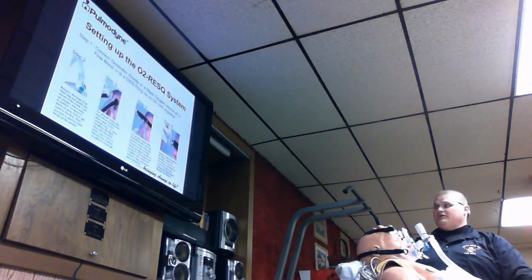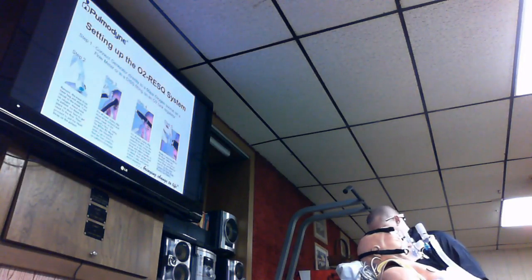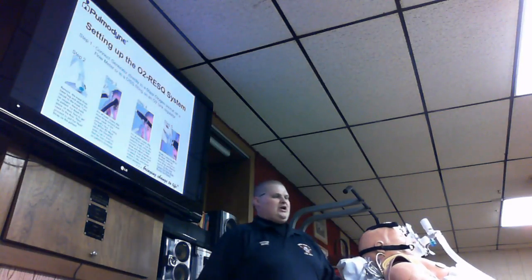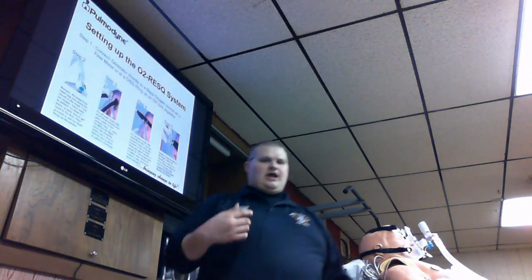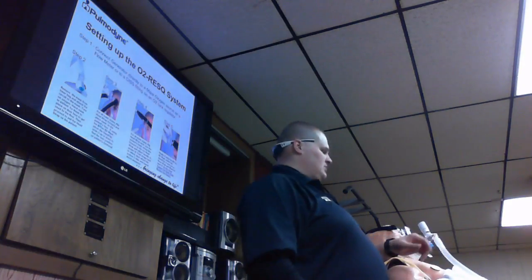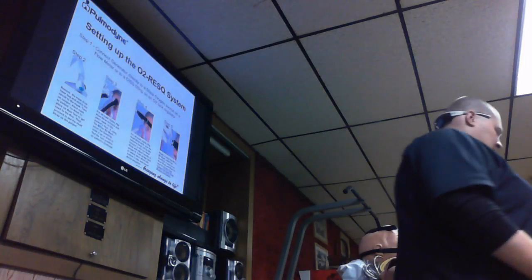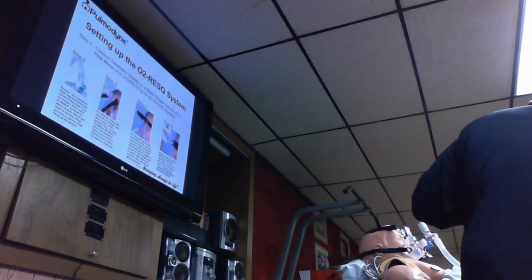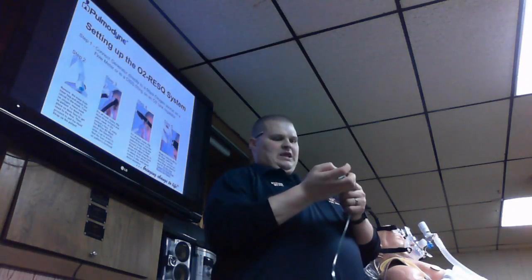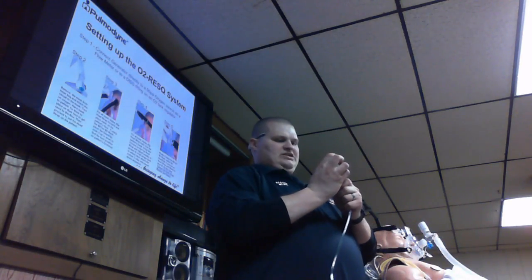So once you get that put on, what you're going to do now is monitor your patient. You're going to check vital signs. You're going to check your SpO2. Make sure I got an increase in SpO2. Then after that, you're going to check heart rate and stuff like that. Double check lung sounds. If you need to, you're going to fill up your O2 or your drug like such. Okay? You're going to hook that on like such.